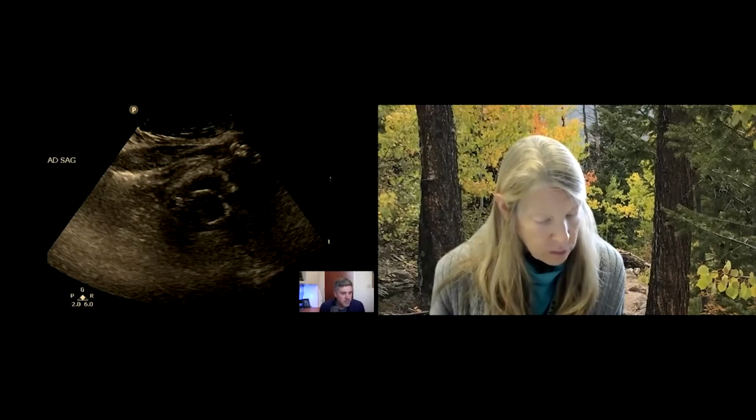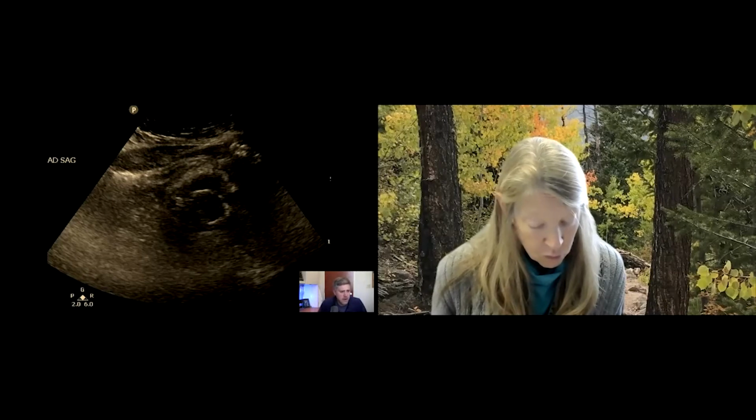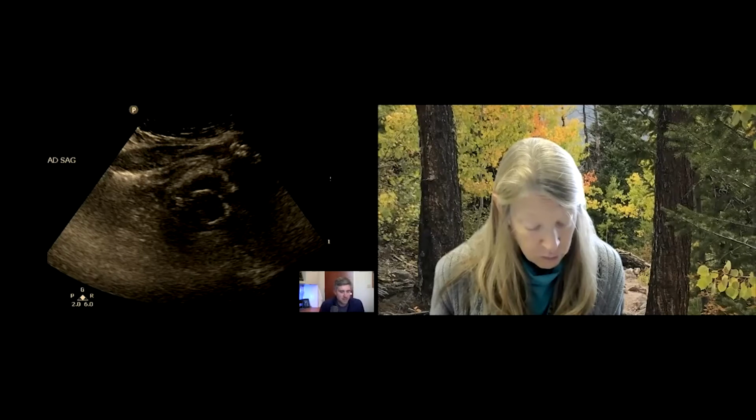But you can see in this situation that we have a bladder that's decently decompressed around that Foley. There's not a lot of fluid inside that bladder. And so if we get no urine output, this probably isn't a problem with the Foley as much as it is a problem with the patient not producing the urine, or just us not cataloging and collecting that urine appropriately to measure the outs for the I's and O's. So it's not a Foley problem in this situation.